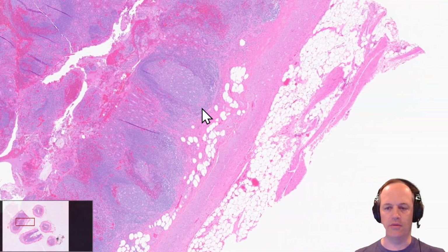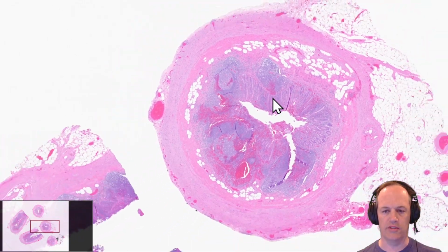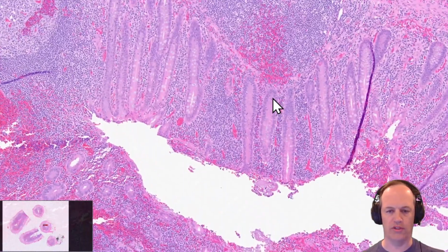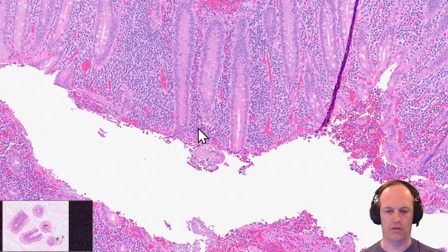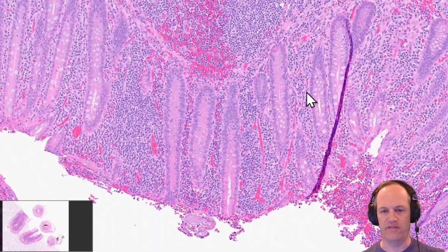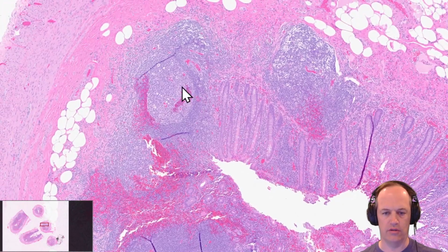Let's talk for a second about the histology of the normal appendix. What's normally here? Because this is going to help us understand what abnormal looks like. The mucosa here looks like normal colonic mucosa. You have columnar epithelial cells, you have occasional goblet cells, and you have some lymphocytes in the lamina propria. But you'll probably also notice that there's a lot of lymphoid tissue here.